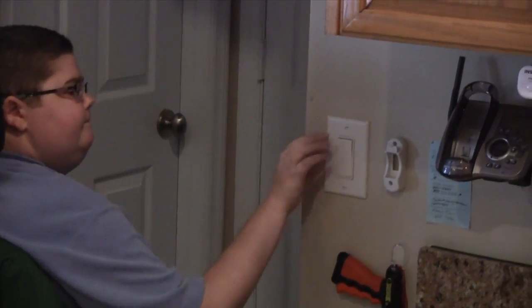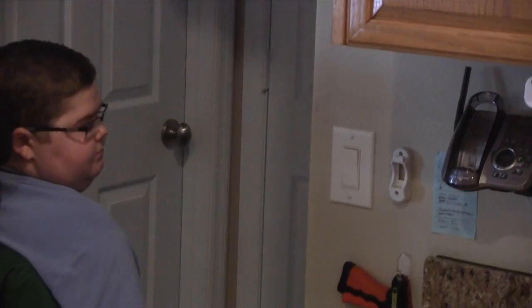This is Zachary turning on and off a light switch.